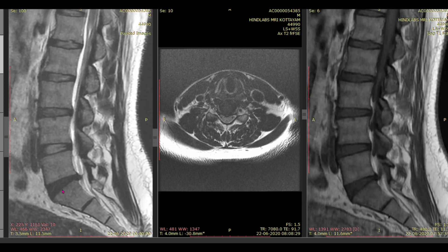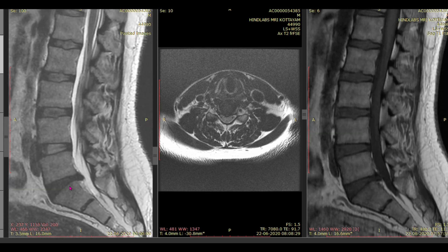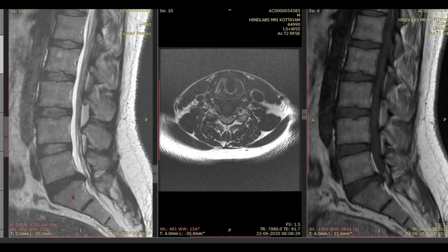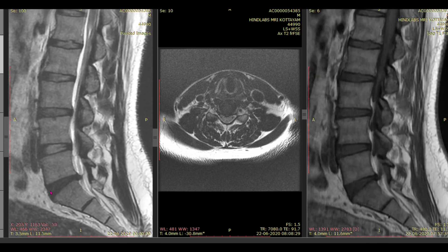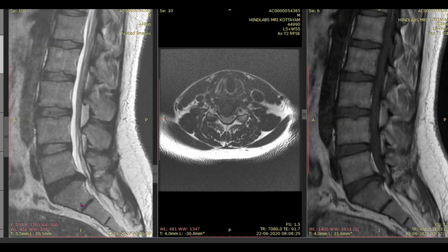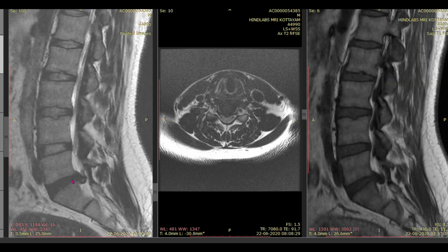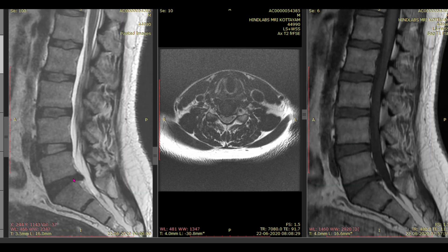When a disc loses its water content — when the disc desiccates — it loses its bright T2 signal and becomes dark. In my report I will mention this as: 'L5-S1 intervertebral disc shows low signal, suggesting disc desiccation' — or you can write 'dehydrated disc noted at L5-S1.' Whenever you mention a disc, also mention the height. Here the anterior part is a little wider and the posterior part narrowed, so mention 'mild asymmetric narrowing of the disc space towards the posterior aspect.' Don't use the term 'wedging' as it can confuse the reading clinician.